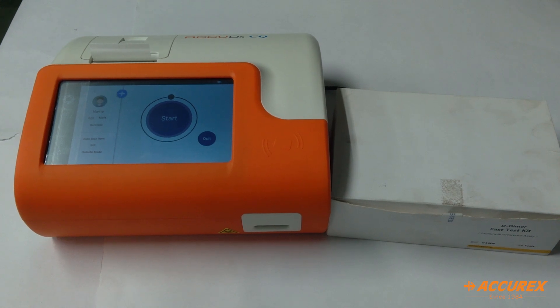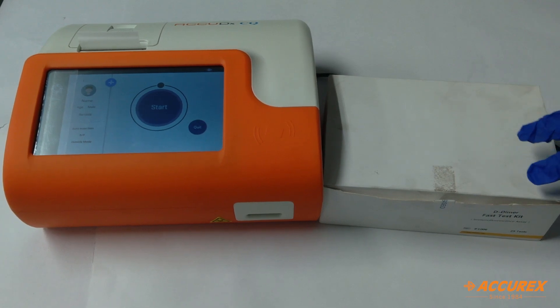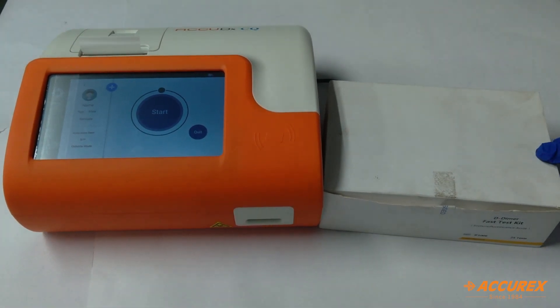Hello everyone, greetings of the day. Today we'll see the D-dimer fast test kit. D-dimer is basically used to check any issues related to blood clotting in the body. Now we'll see how to test this and how to use this test kit.